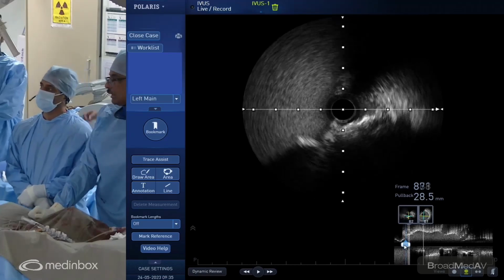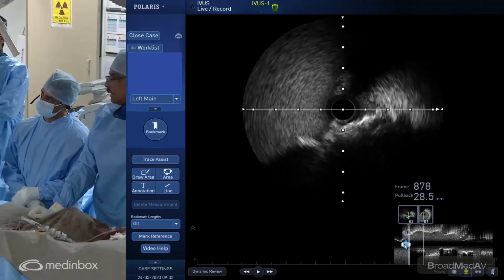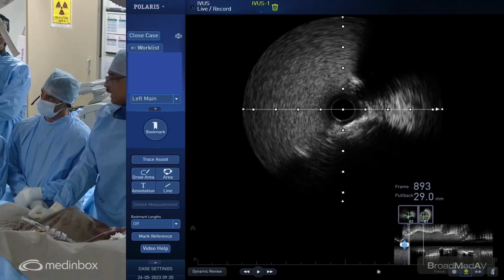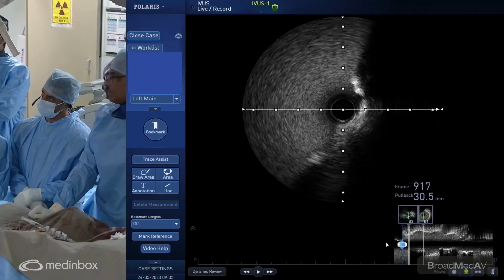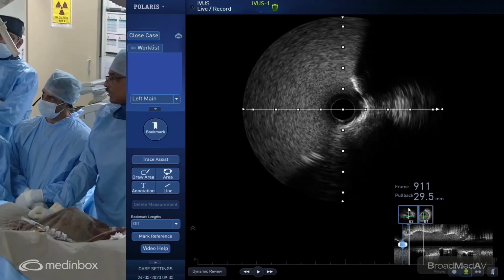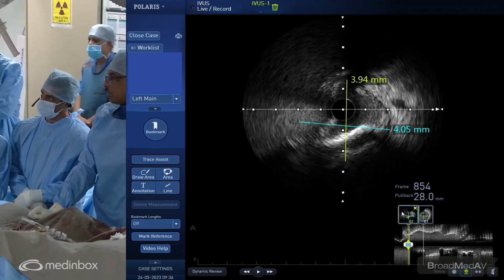Even if you have a wire bias on the rotablator, we're not going to have that. So the first issue, do I need IVL or not? The answer may be yes. We could possibly get away with no IVL, but I plan to use the IVL here. The next issue is what diameter. As Dr. Nandakumar said, the contact is at about 2.7, 2.8. Is that right, Nanda? 2.5 is the lumen size, where the vessel size is 4.